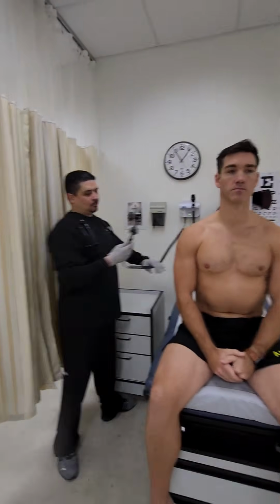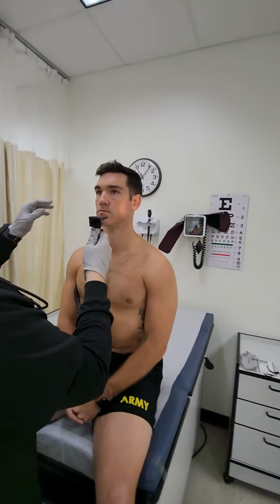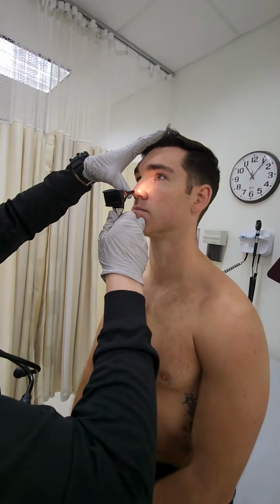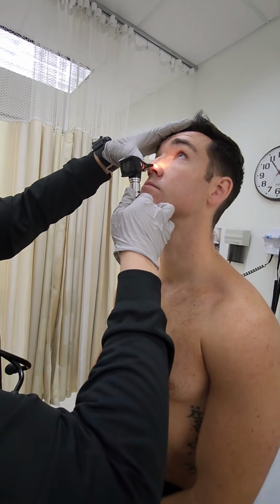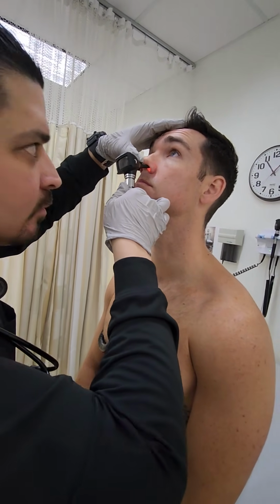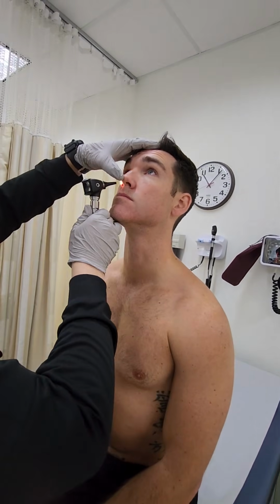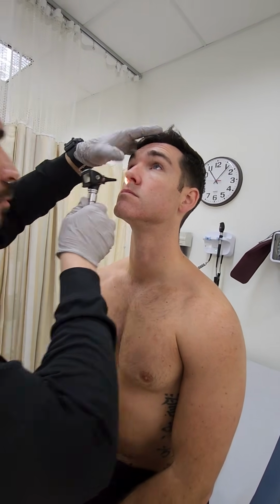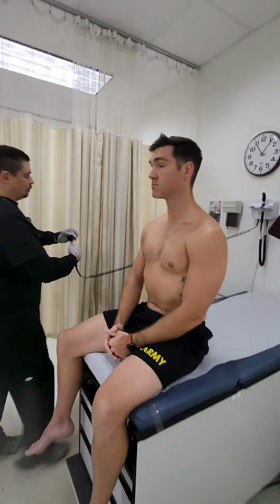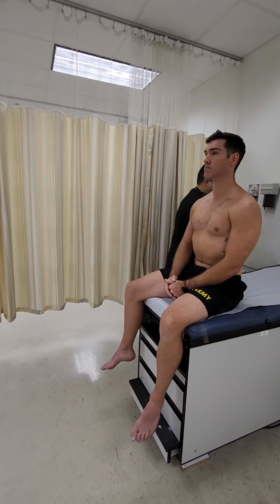Inspect septum, turbinates, and floor of nasal cavity. Inspect mucosa for color and lesions. Inspect for discharge. Technique: ask patient to tilt head back, just lightly as needed, and examine with the speculum all areas of the nasal cavity. Perform bilaterally. Verbalize, mucosa is pink and moist without lesions.